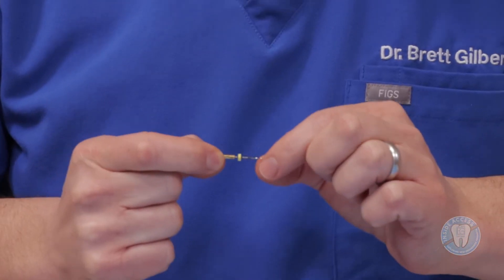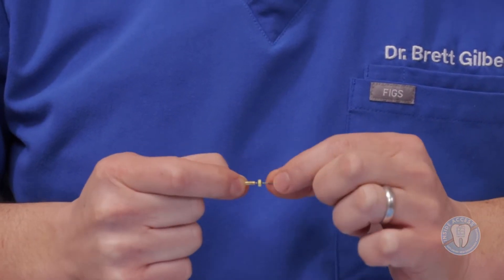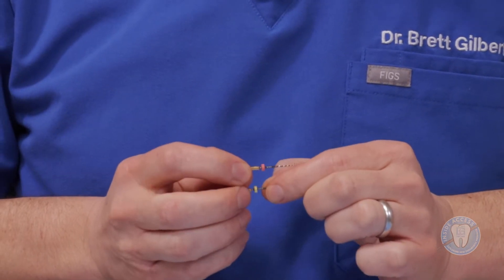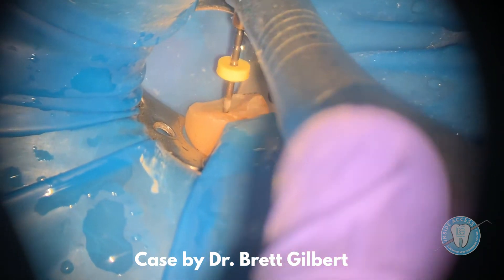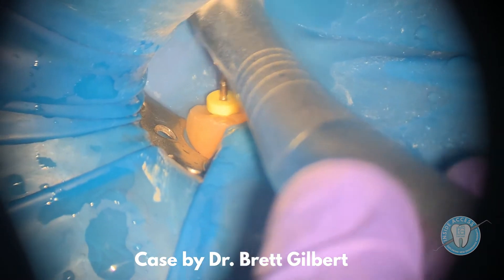Creating a glide path with the newer instruments is going to be the key — very strong, very flexible. As we now have created this glide path, we want to start to apically enlarge. This is going to be the Zenflex — a very flexible instrument. It comes in both an 04 taper, indicated by the yellow stopper, and also an 06 taper, indicated by the red stopper. In my clinical practice, I typically prefer an 04 taper, but each clinician needs to make decisions on which sizes are appropriate for the case they're treating.